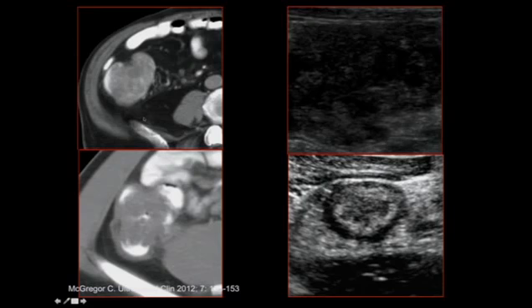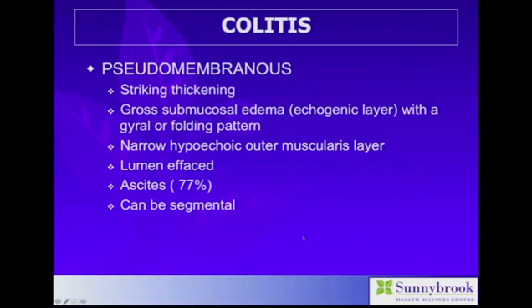When we take this first patient to ultrasound, we see that the lesion corresponds to marked asymmetric thickening of the right colon with complete loss of bowel wall layers. We have no peri-gut inflammatory changes, we have no diverticulum, and this is a classic appearance of an adenocarcinoma. Take the second patient to ultrasound and the appearance is much, much different. Now the bowel wall layers are completely preserved. We have a beautiful external muscular layer, a beautiful submucosa, and a muscularis mucosa, and this now excludes a diagnosis of malignancy, and in addition we're able to demonstrate the diverticulum at the epicenter of maximum wall thickening and inflammatory change. Finally, we're going to discuss colitis.